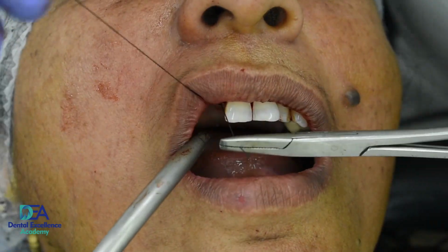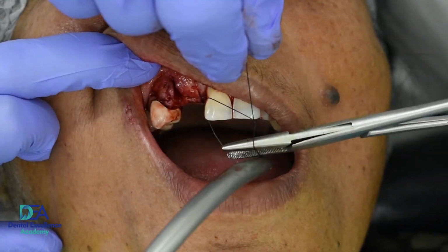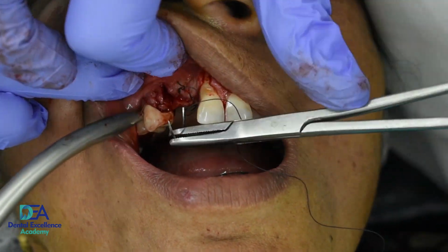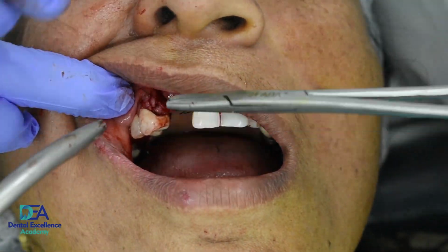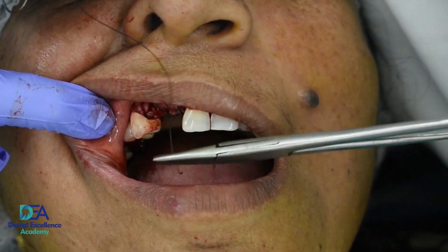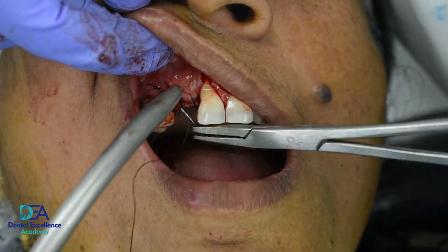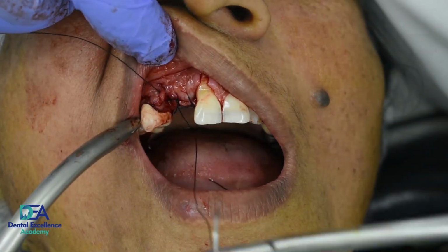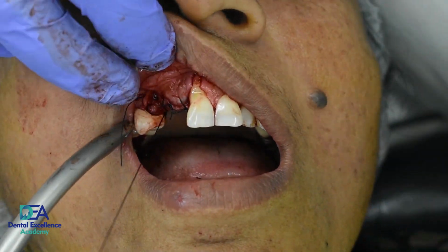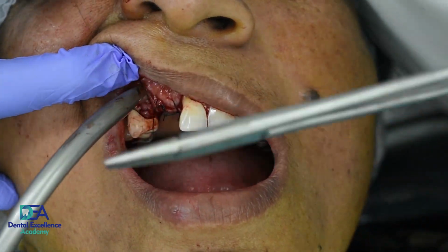So we'll be starting with the suturing. I'm just fast forwarding the video here just to give an idea. You should give a watertight suture. In the canine region, we have to pull the gingiva and close the socket. Now I am giving a figure of 8 suture in that region so that I can close it properly. You can see we have closed it.